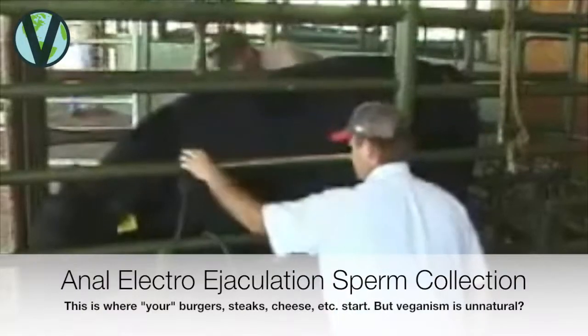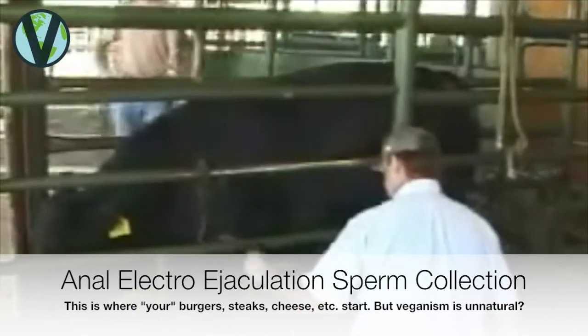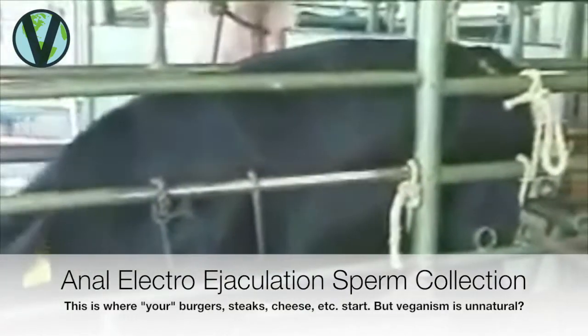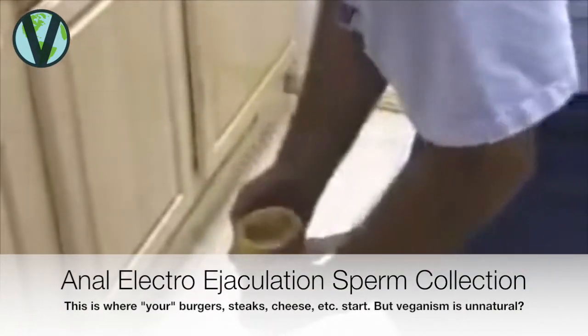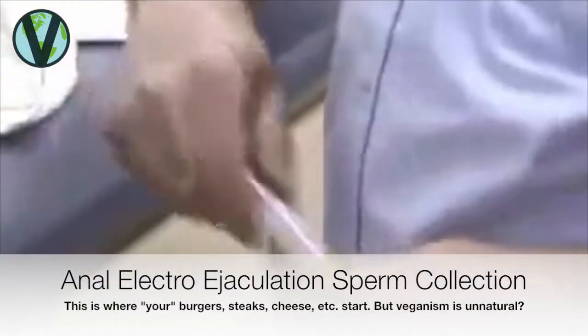To prepare to electroejaculate the bull, he's brought into a confinement area where we utilize ropes to keep the animal from going down on his front legs when we're actually collecting him. We prepare a cone with a test tube or a conical tube to collect the semen, in which we also would provide insulation around it to prevent cold shock during the collection process.